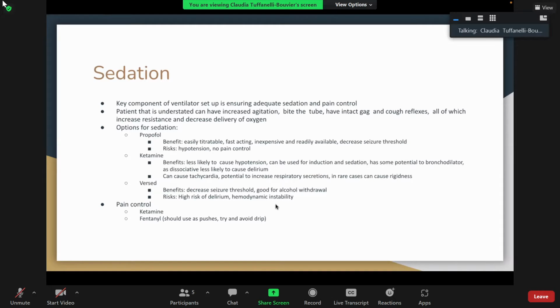For me, part of the ventilator setup is sedation. If you don't get anything else from this lecture, you can talk to your respiratory therapist and have them do all the settings, that's fine. But it is up to you to do sedation. It increases the risk for complications, for intubation, for mechanical ventilation, to have a patient that's not sedated. These people have prolonged ICU stays. They have long-term complications. A lot of badness if they are intubated without meds, all the studies show. So please try to put your patients on sedation as quickly as possible.